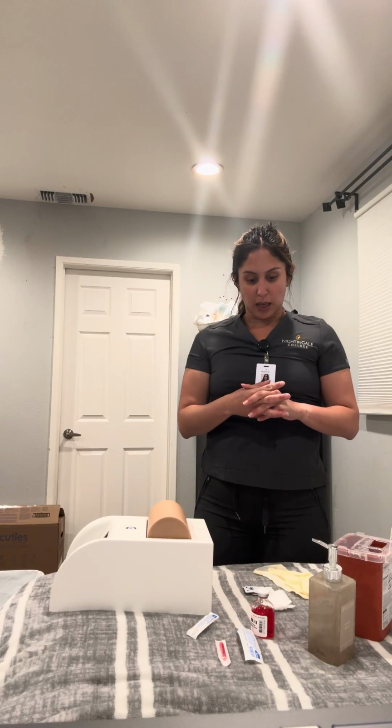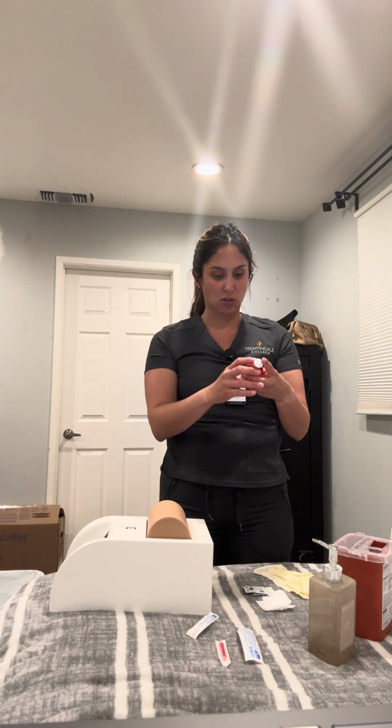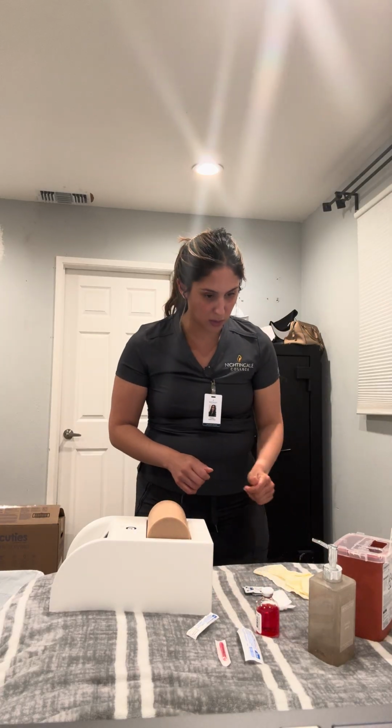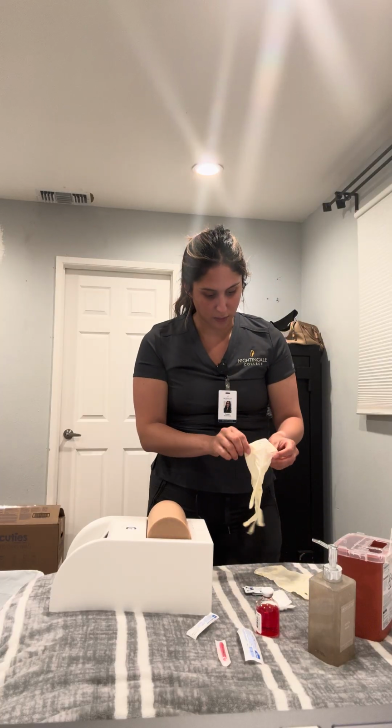Next, again, we're going to compare what we have. It looks like the doctor has ordered for you 6 milligrams IM. This is going to be an injection, 1 dose for your pain. So again, we're going to perform hand hygiene and put on our gloves.